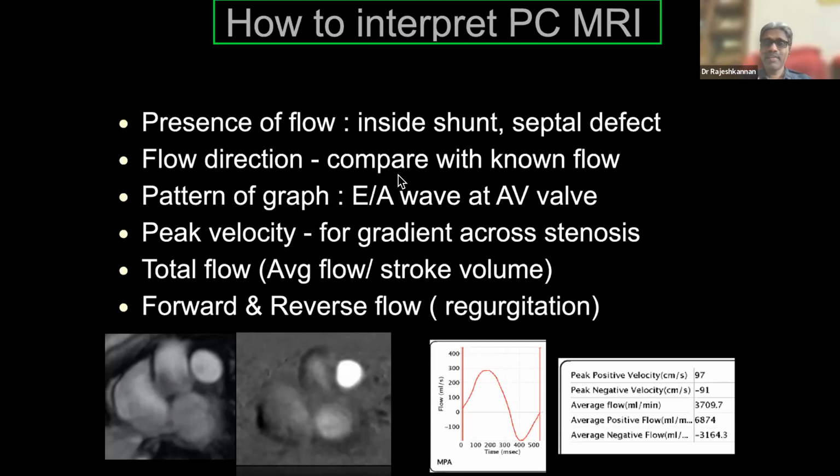So if you are having some vessel lateral to the arch of aorta, and you want to differentiate whether that is a double SVC versus a vertical vein of the total anomalous pulmonary venous connection, you know that if it is an SVC, it will flow from superior to inferior direction, whereas the vertical vein of the TAPVC will flow from inferior to superior direction. So you can look at the flow direction.